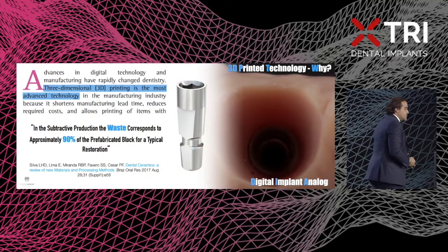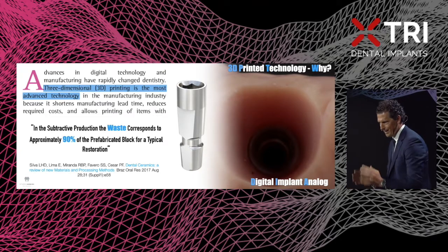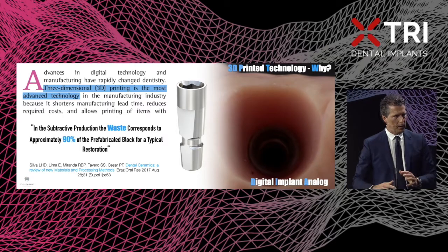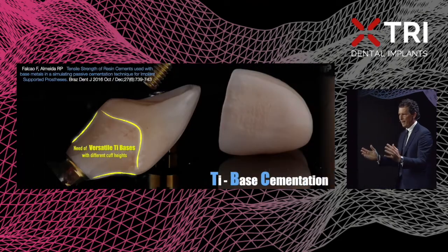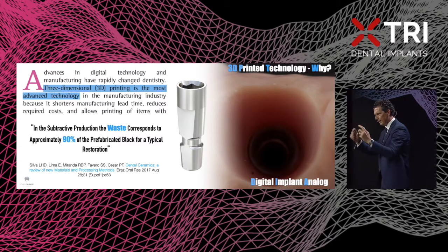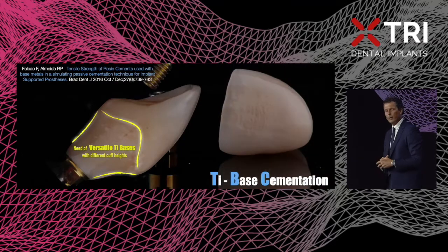Moving forward in this workflow, we also had to 3D print a master model. If you want to create a model, obviously you must have the analog, and the analog derives from the scan body. So from the scan body, we have the titanium base and the analog for the model. If you manage an aesthetic area, obviously you must have a model, because the technician must layer the crown with the feldspathic ceramic and check the contact point of the crown.